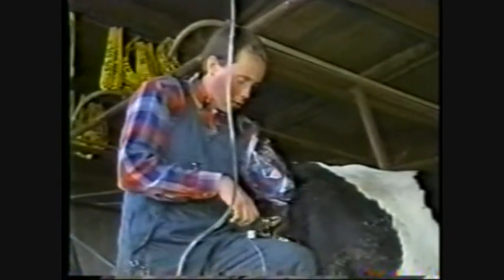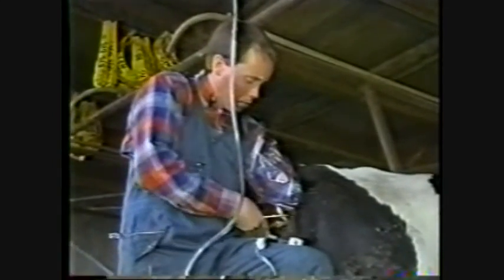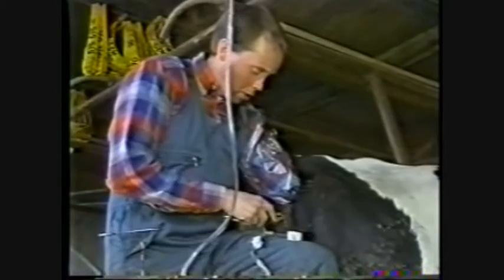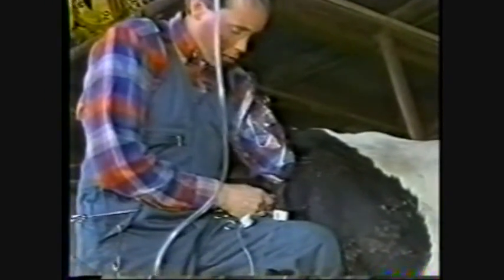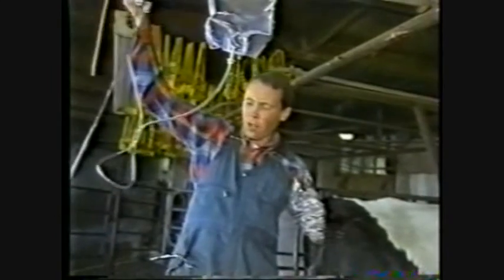Okay, the left horn. Take the air out of the catheter. Take that bit of poking inside the injection spot. The air will come out. Remove your catheter. If you have fluid left in the tubing, you let it drain down into the filter. You're okay there. Go ahead and drain it on down.